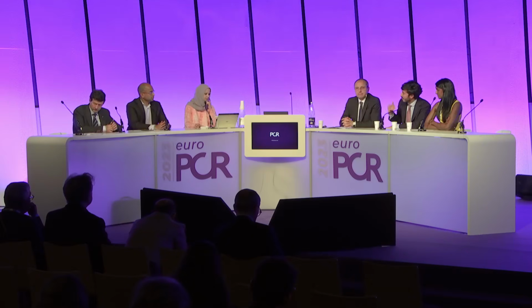Because rotablation essentially paves the way for the passage of balloons and other materials. But I think that it's important to see how many cracks we have created in the calcium. And so the only thing that I can say is maybe I would have done another run after predilation. I think the result is okay for this case because it was a quite complex case.